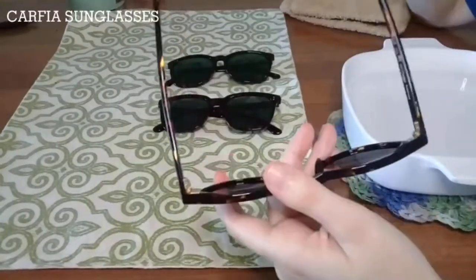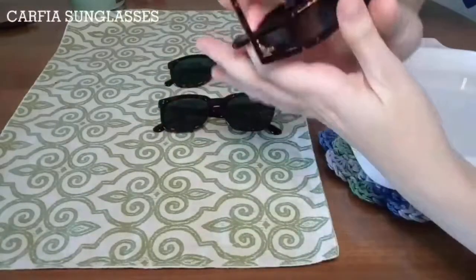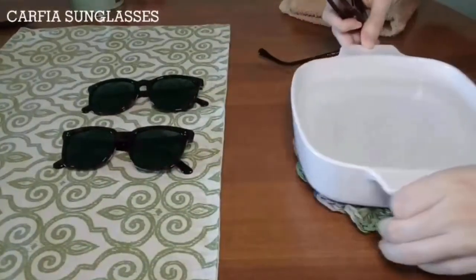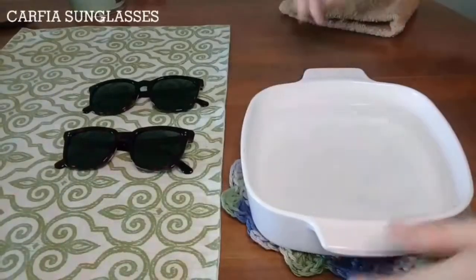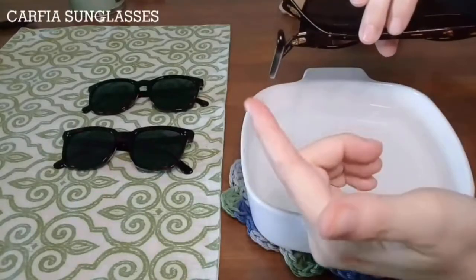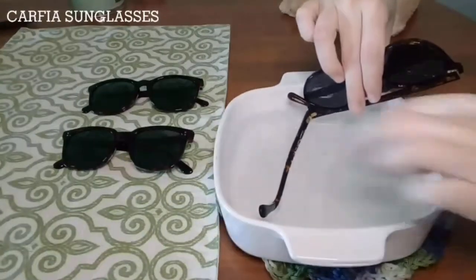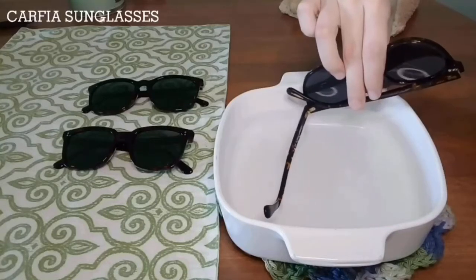So I'm going to go ahead and show you how to adjust this, and the first thing we're going to need to do is fold one temple in and get ready to submerge basically the whole temple in the water. So we're going to be bowing it out or putting a curve in where one doesn't quite exist yet. So I'm going to submerge this whole temple in the water here. If I were just adjusting this back piece, then I would just put that in, but for now we're going to just put this whole thing in because that's the only way that we're going to be able to reach the part that we need.